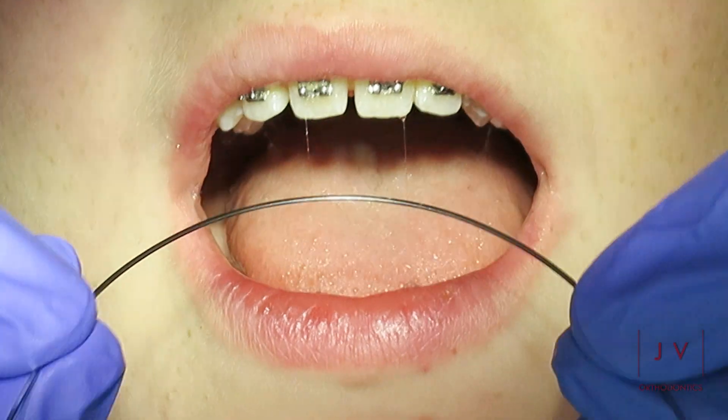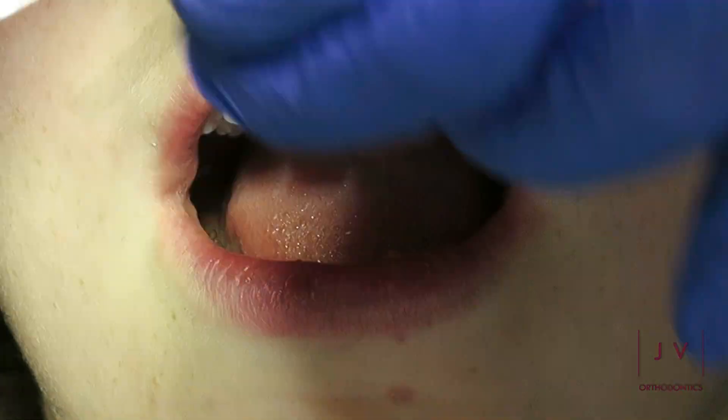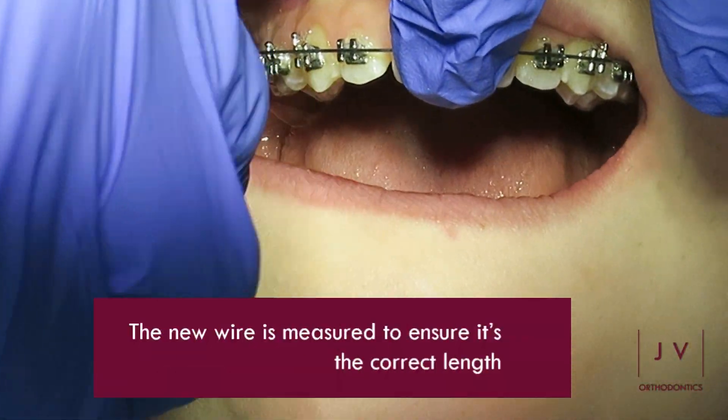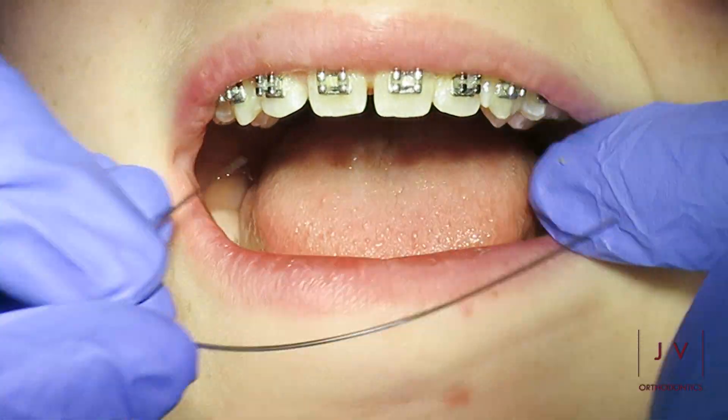The next step is to measure the new wires that we are going to fit, to make sure that they do not end up being too long, because otherwise they can sometimes poke out of the back of the last bracket and that can lead to some discomfort.